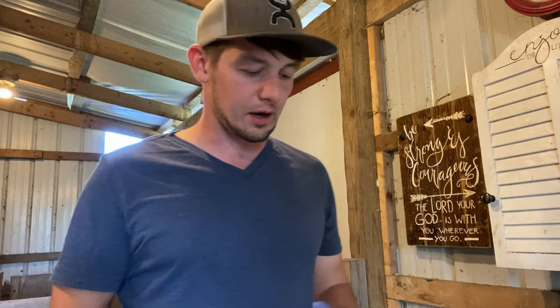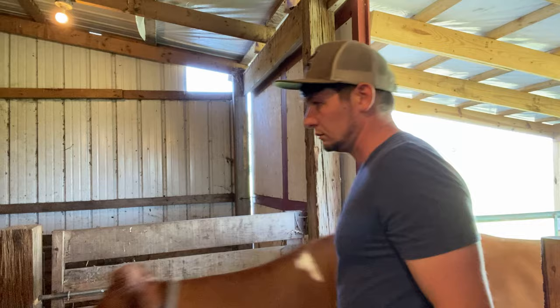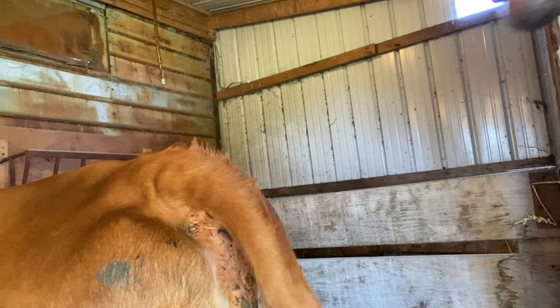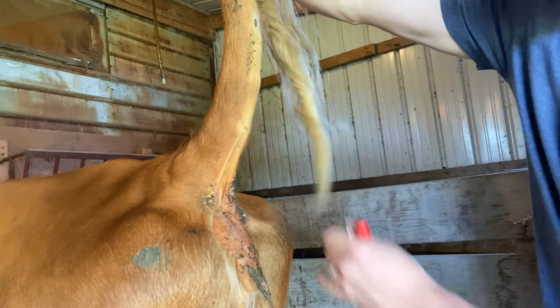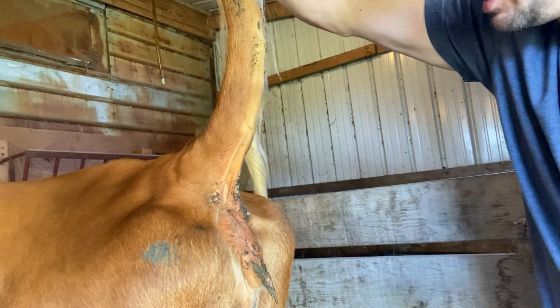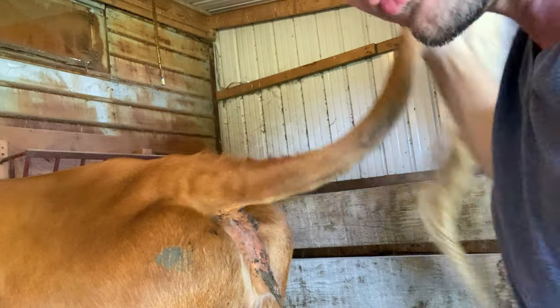I need two cc's of blood. Send that in and find out if she's pregnant or not. Come on, Maddie. So what I'm going to need to do is lift up her tail straight up. There is an artery that goes up the center of the tail. I'm going to poke the needle in there to draw the blood. First, what I need to do is clean that off real good. I'm going to use some of the wipes that I use every morning before milking.